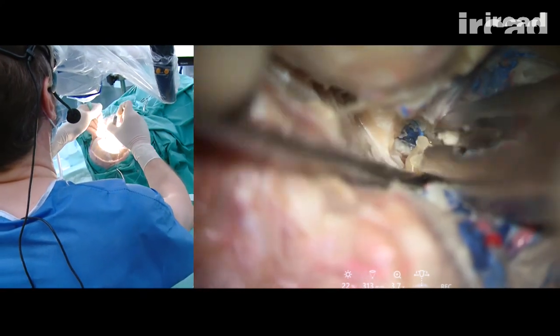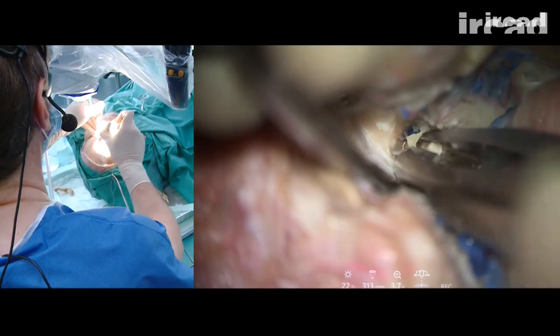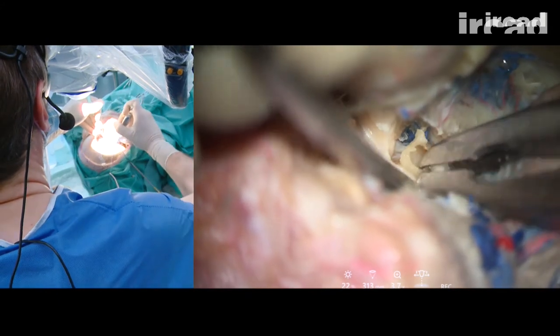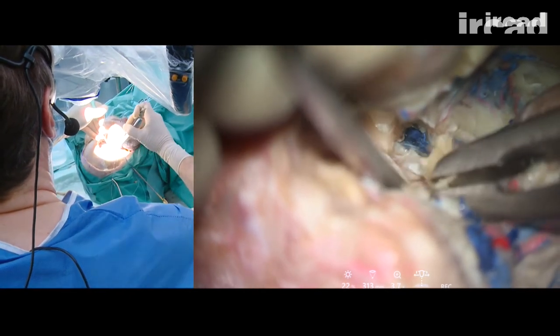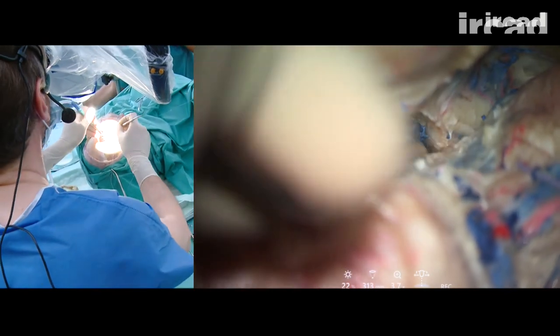I have no small instruments to take it out, so I'm going to use this. It's a little bit big, but okay. The tip of the clinoid is out.